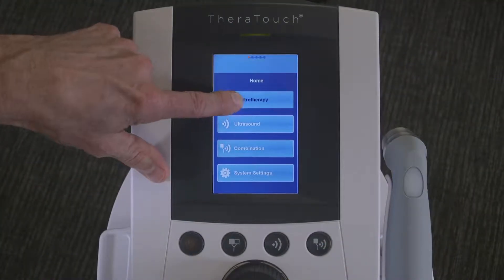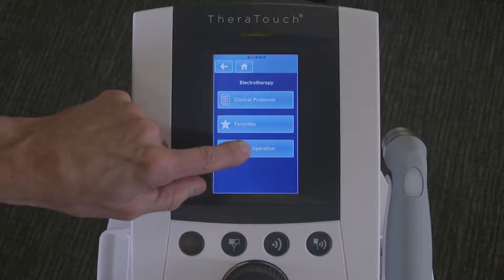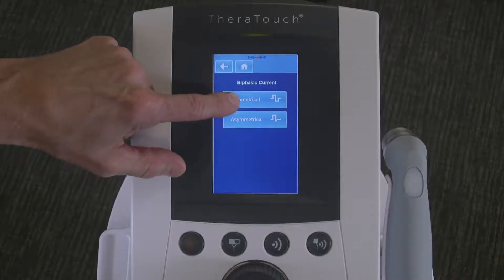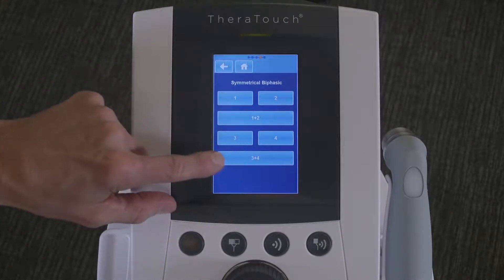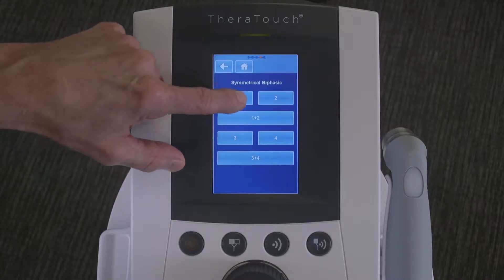First, you're going to select electrotherapy, manual operation, biphasic — symmetrical biphasic — and we want to make sure that we select the appropriate channel that you're using, in this case channel one.